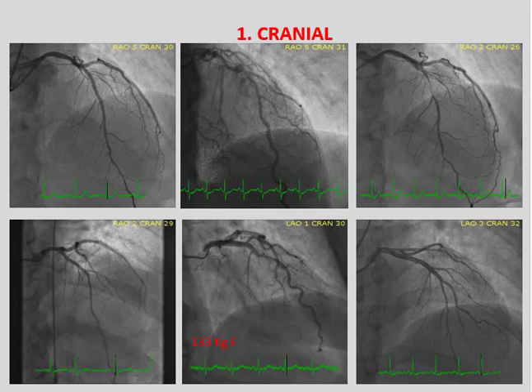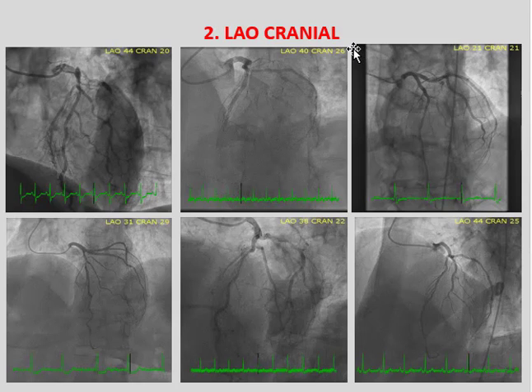Remember this cranial. This is an LAO cranial, meaning your head is still tilted forward. The II, or the detector, is up towards your head, looking downwards at an angle, but it's also tilted to the left, LAO cranial, and that gives you that football shape that we saw before, standing on its head. The seam of the football is here, there, there, there.